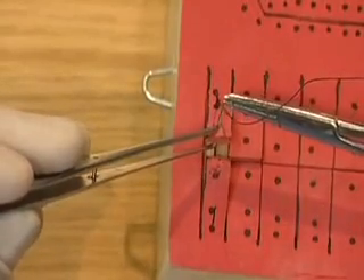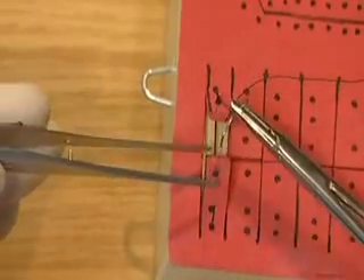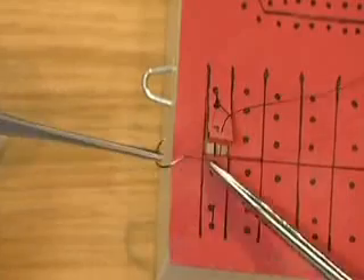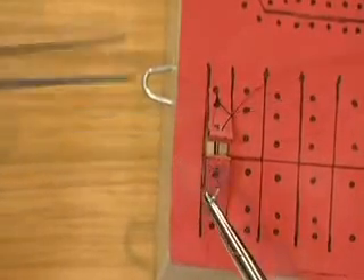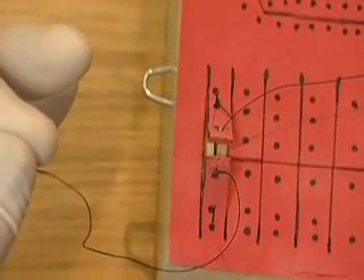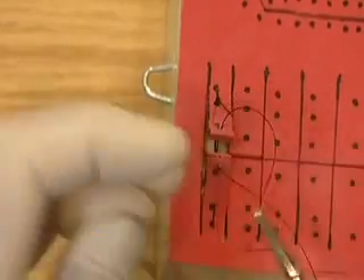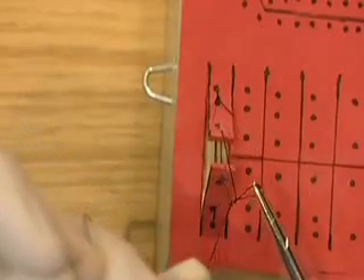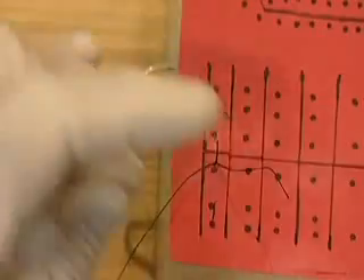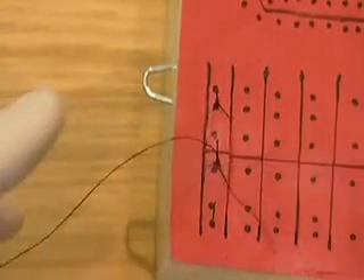Doing the interrupted suture. Picking up the needle with a reverse grip, going at right angles to the incision line. Pick up the needle with the tissue pickups, then lock the tissue pickups. Taking the needle, going over, over. Picking up the thread and pulling it tight. Getting the knot away from the incision line. Going under once, pulling it through, then going over once.